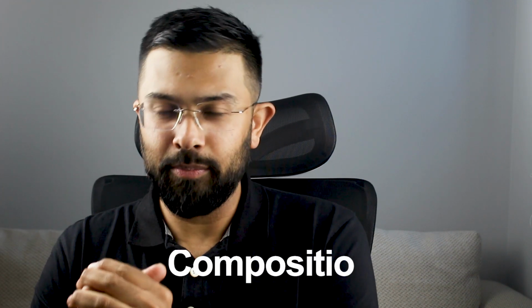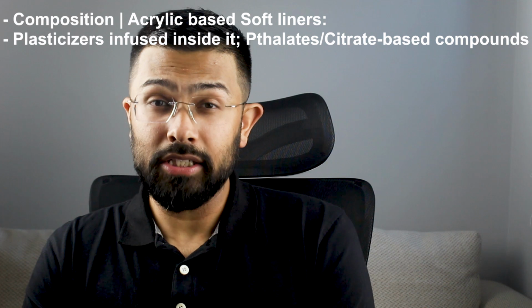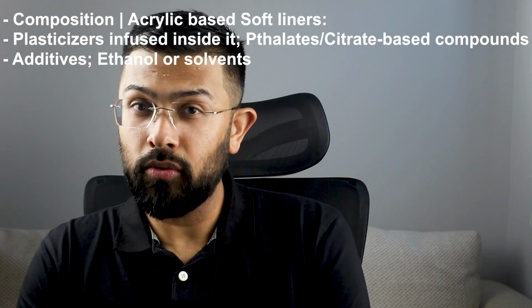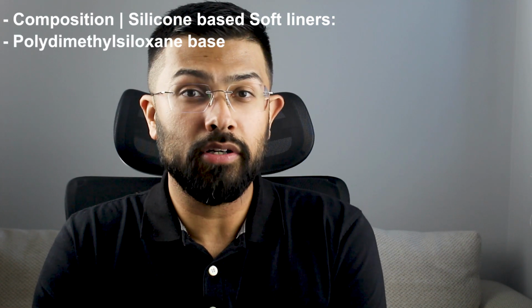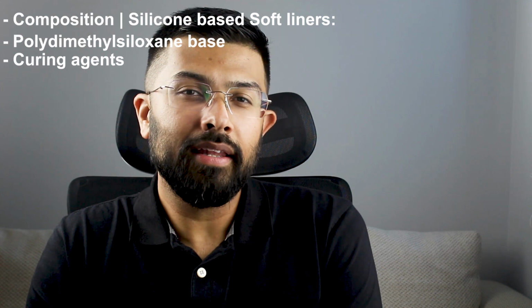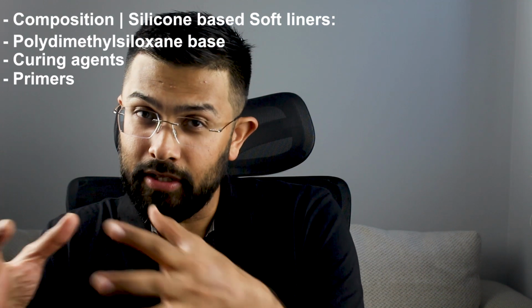Now, let's talk about the composition of these soft liners. So, acrylic-based soft liners like polymethyl methacrylate have plasticizers infused in them, like phthalates or citrate-based compounds. They also have additives like ethanol or solvents. And now the silicone-based liners consist of polydimethylsiloxane base and curing agents that help cure the material in heat or room temperature cure. And then there are primers for bonding to acrylic denture base. Remember that. Silicone soft liners require primer to bond to denture base.